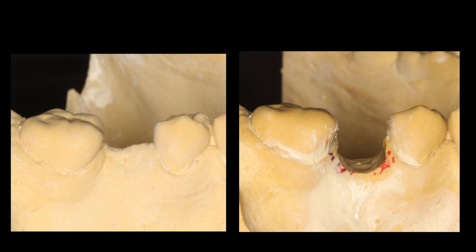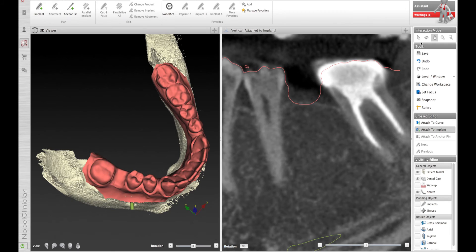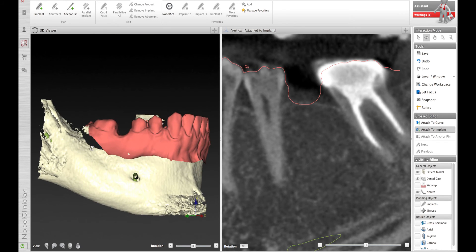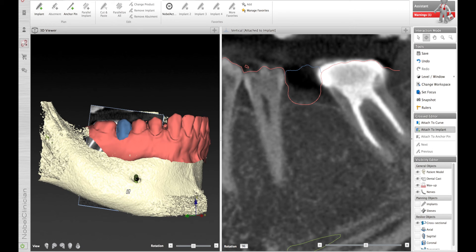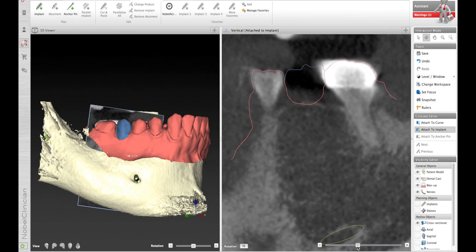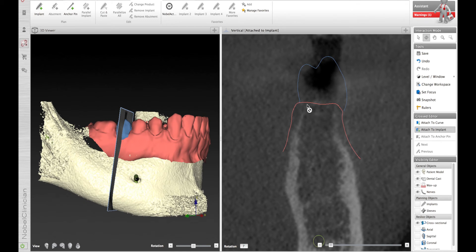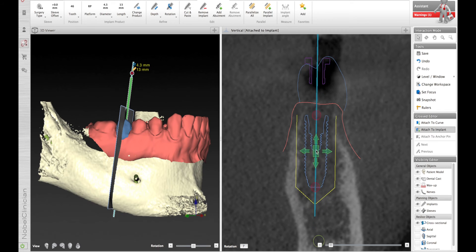What I like to do is cut back the model prior to scanning, reducing it to where I want the free gingival margin to be in a three-dimensional format. Once rescanned, we can improve the planning capabilities in Nobel Clinician by knowing where we want the soft tissue to be — right at the bone level, with three millimeters of soft tissue around the implant. We want to submerge this implant slightly to have ideal bone, ideal soft tissue, and ideal emergence profile. You can't plan solely based on what's currently there, as there's often too much soft tissue and bone is thin at the crestal area.